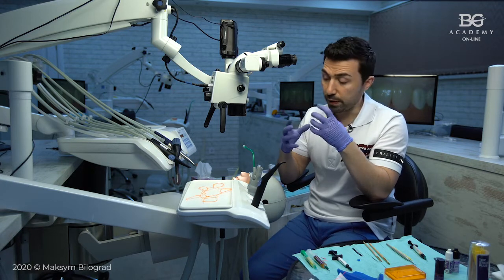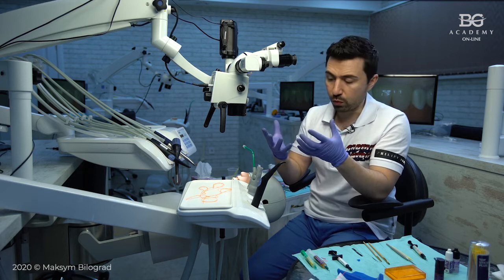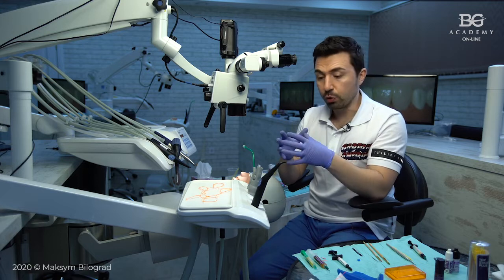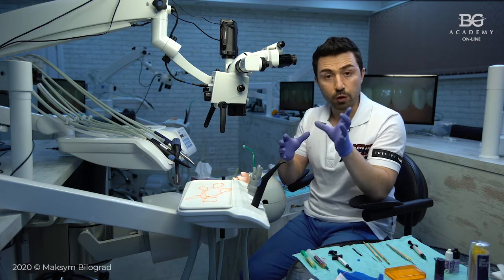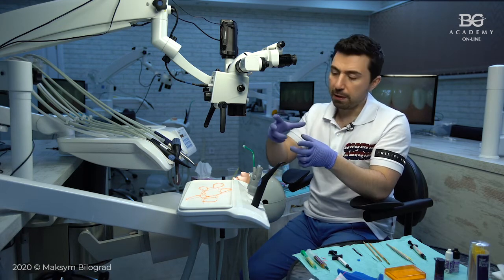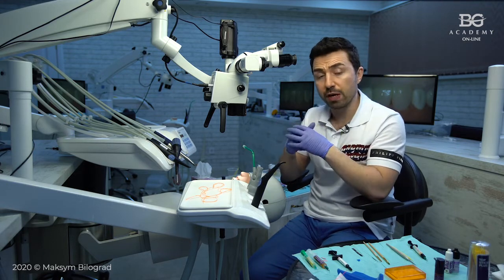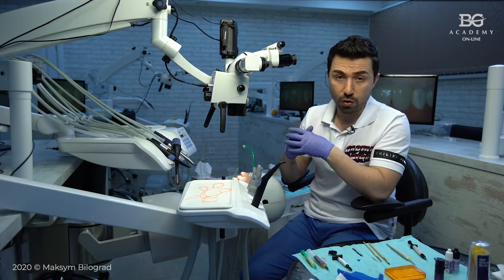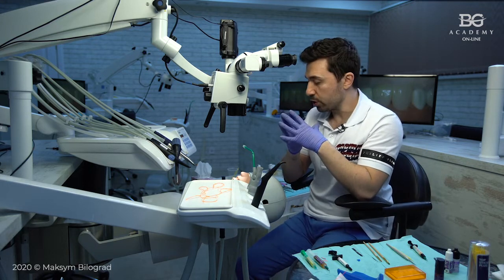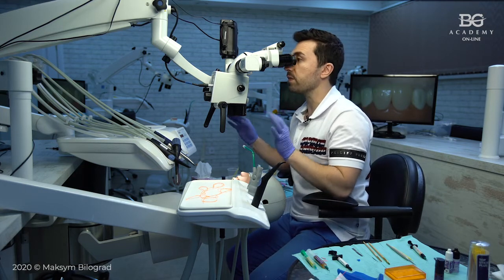But to be able to understand who is right, who is wrong, we can analyze our cast model, okay? Like it is control cast model. You have the control cast model of your prepped teeth. You have the silicon index that we are using for prep control, and then you can put this silicon index over the cast model and just evaluate if there is enough space for your dental technician that you discussed before, or it is not. Okay, so these are some tips on how you can make some evaluations.